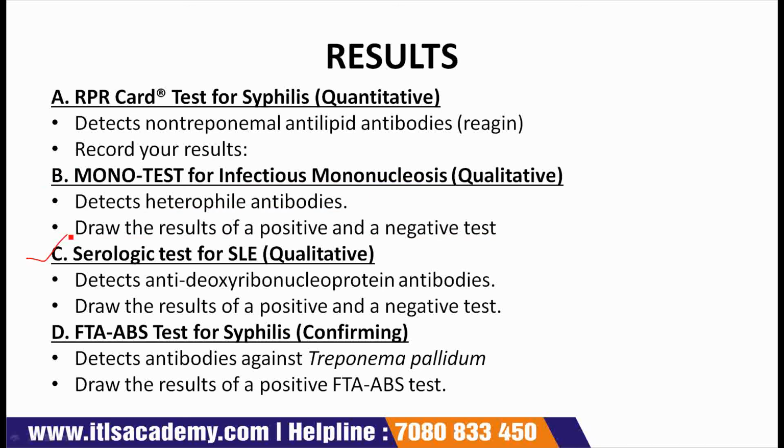Next is the serological test for SLE. The first one, the RPR test, is quantitative, while the mono test and this SLE test are qualitative tests.